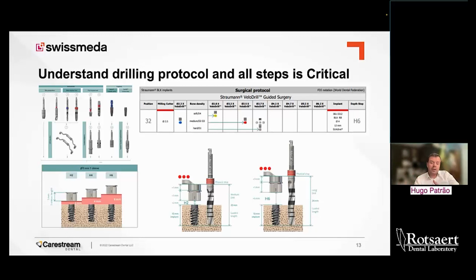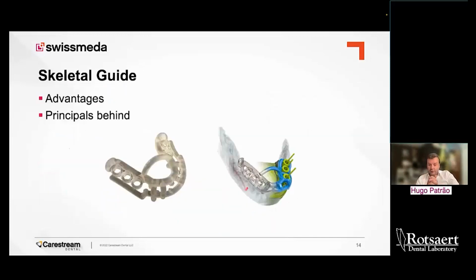And the accuracy is going to be a really nice present at the end of every single surgery that you do. So the takeaway from this slide is take your time to learn guided surgery, not the guide itself, but the drills, the keys, the sleeves. Pick a good one, and then you will enjoy a good guided surgery.